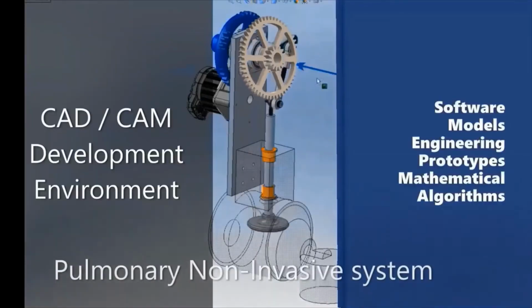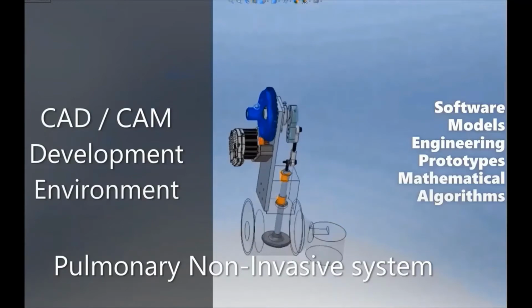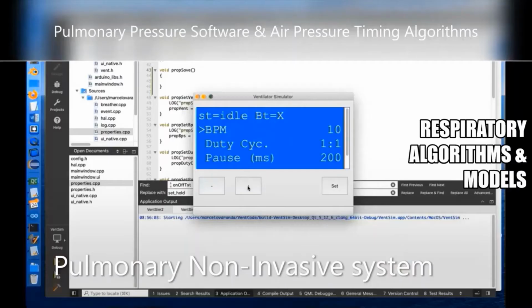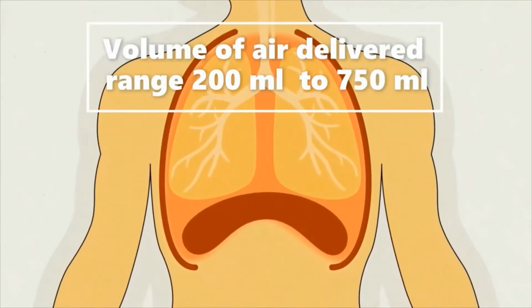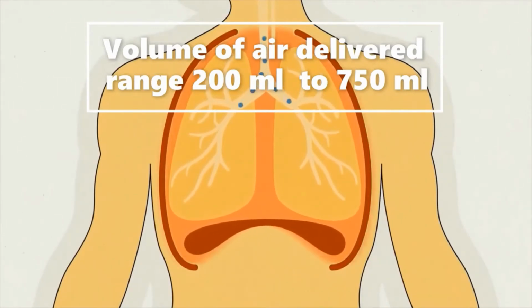The challenge is how to manage the supply of oxygen into the patient's lung and managing the side effects caused by the electromechanical ventilation system, such as barotrauma.